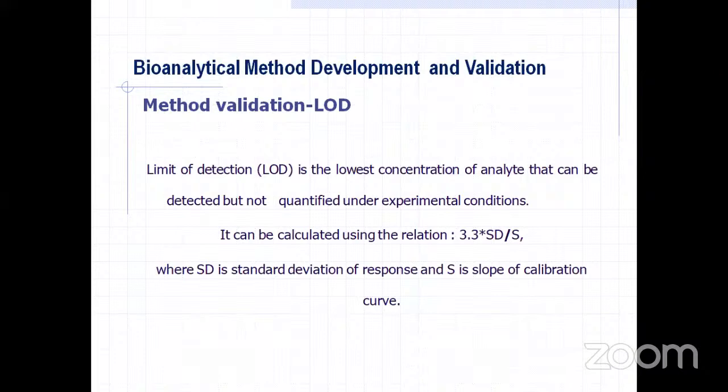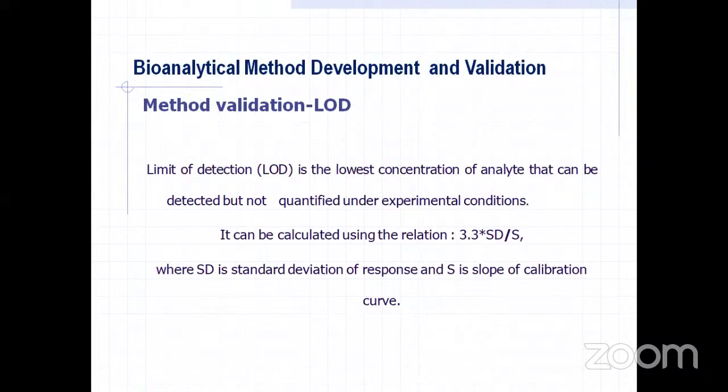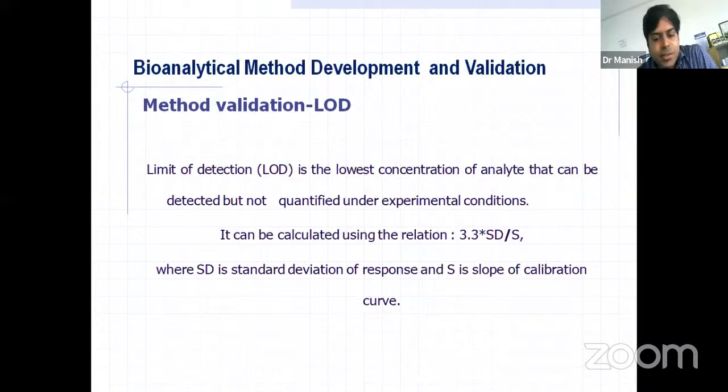Very good morning, sir. While doing this bioanalytical method, how to fix this LLOQ and ULOQ with respect to the Cmax of the drug? Yes, it's a good question. Your question is how you are going to fix the Cmax, or how to prepare quality control standards with respect to the Cmax of the drugs. So what we are studying.